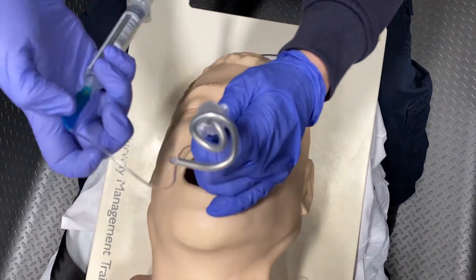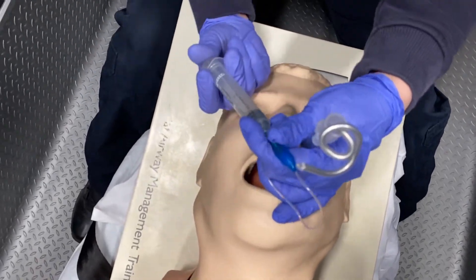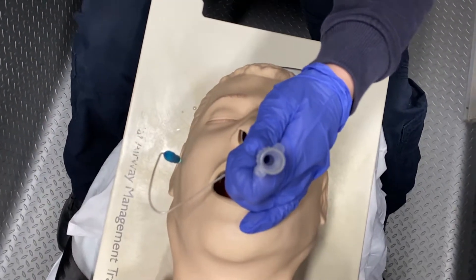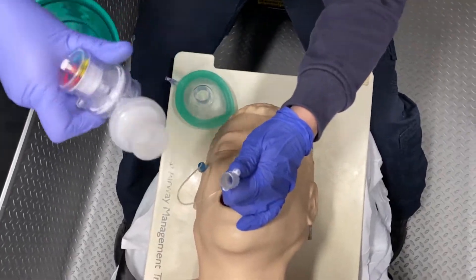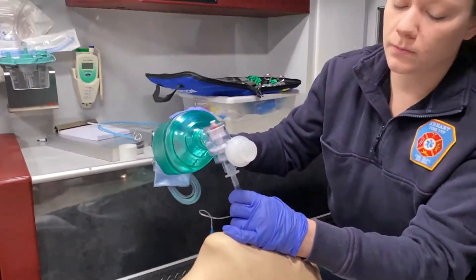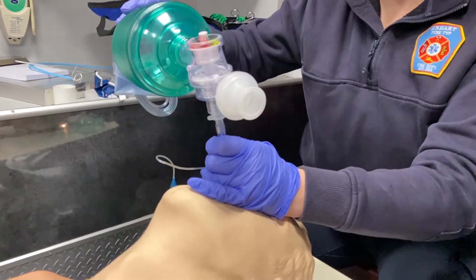You don't want to let go of your tube until you have it secured. I'm going to inflate my balloon, remove my stylet, and go ahead and ventilate my patient. And as we can see, I have good placement with this tube.